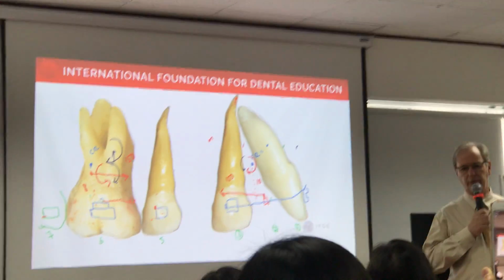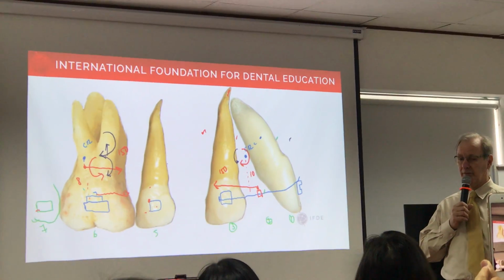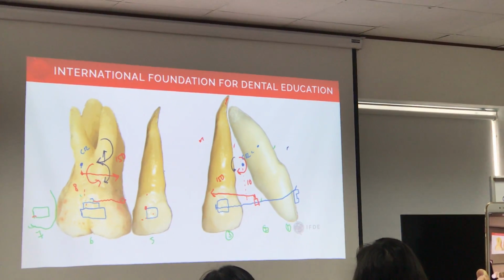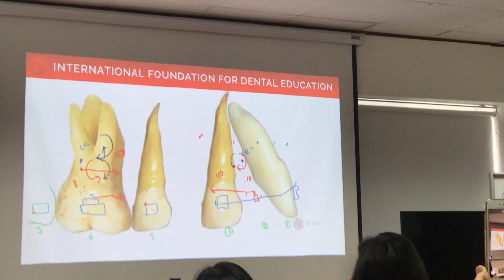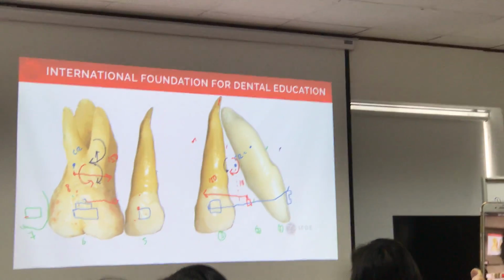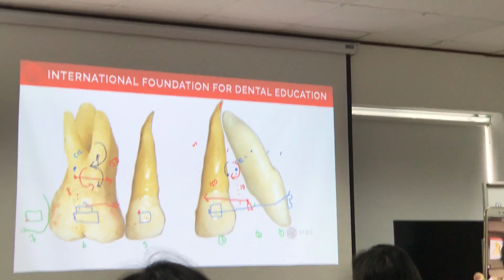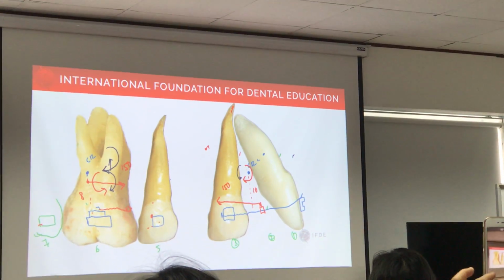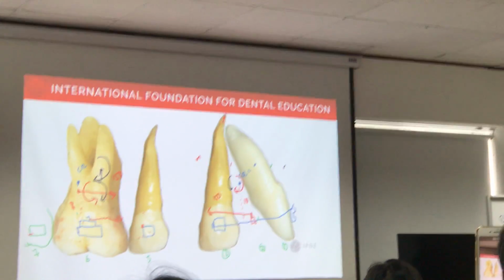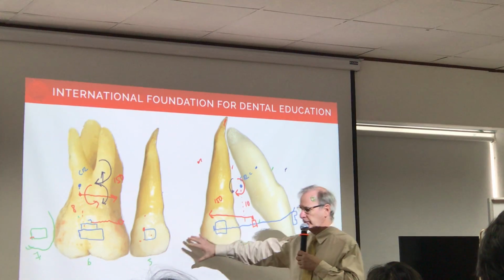Called an interrupted force, and that should be enough to keep the tooth in its position. Will not distalize, but it will keep it there. Yeah. This force and this time will be enough to hold the tooth in position, and that is the interrupted force we apply. Okay, so that's the idea of anchorage.